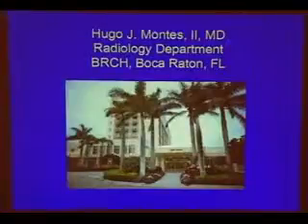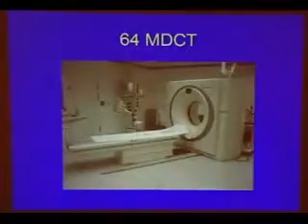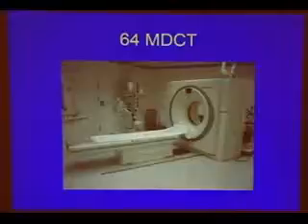This allows us to visualize coronary arteries to a degree that we have never been able to do before. Today I will start by showing you several pictures of our scanner and the procedure that we perform in order to obtain these images.